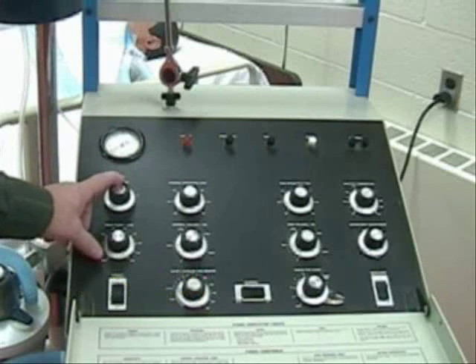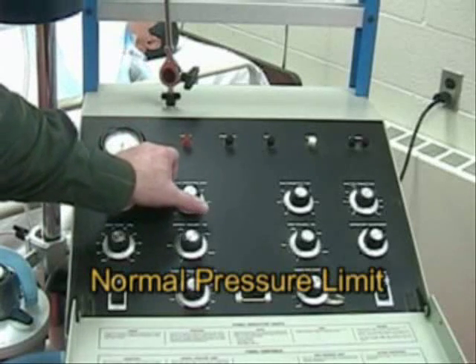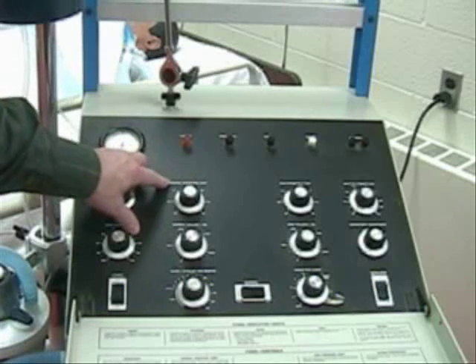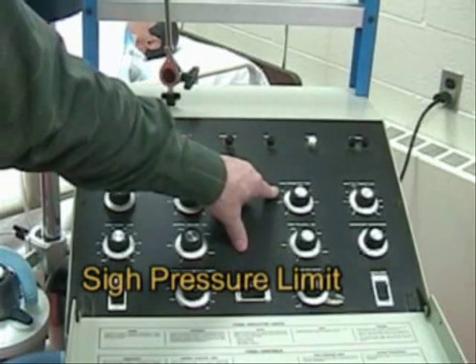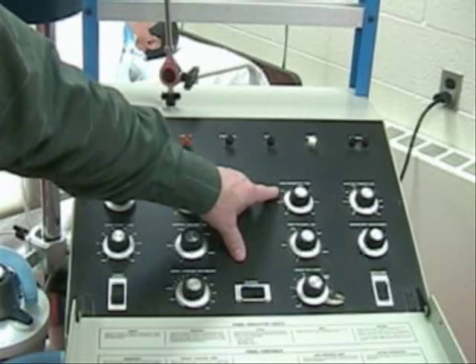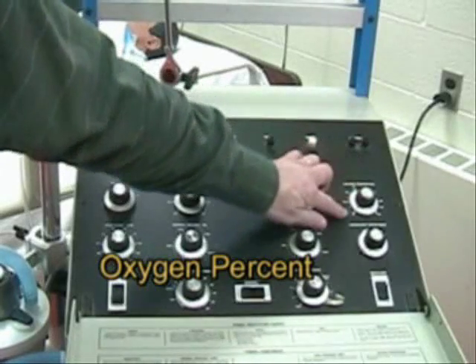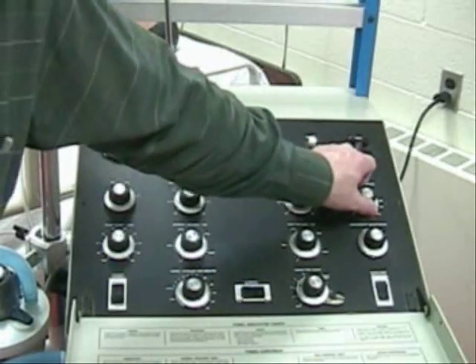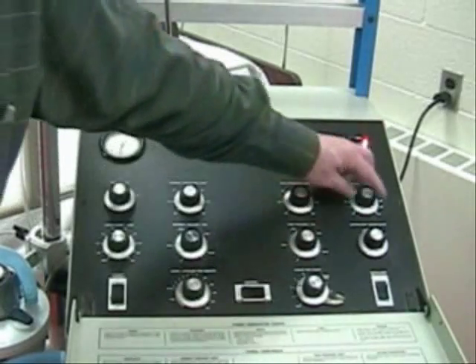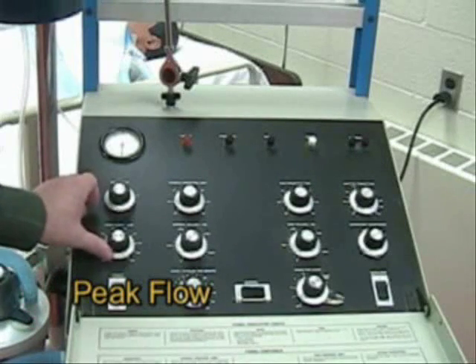We'll talk about setting the sensitivity in just a few seconds. Then we have your normal high pressure limit — this is only labeled 'normal pressure limit.' Then we have a PSI pressure limit. We'll talk about the PSI pressure in a second. We also have oxygen percentage, and if we don't have oxygen plugged in — so we have no gas pressure — we'll get a warning light and alarm. Back here we have the peak flow.